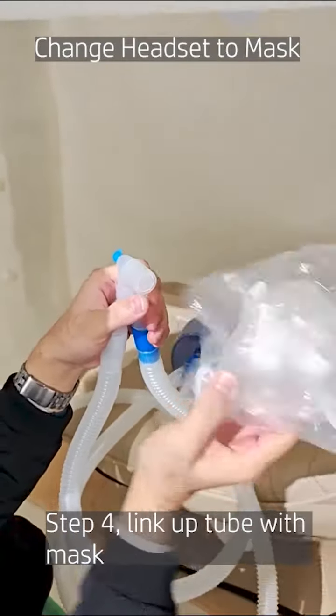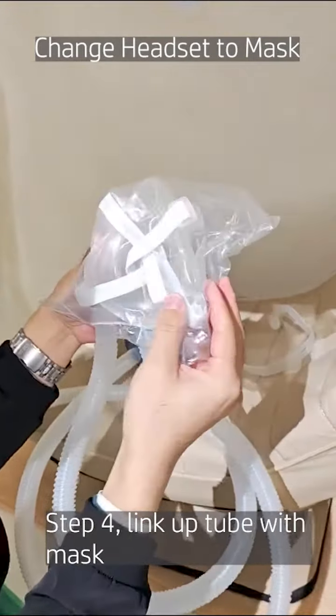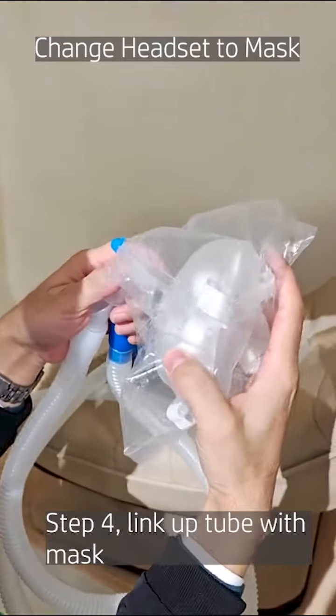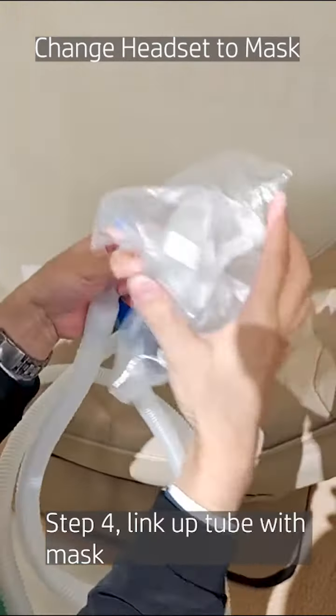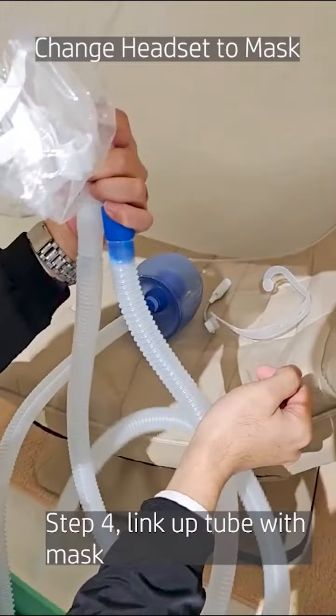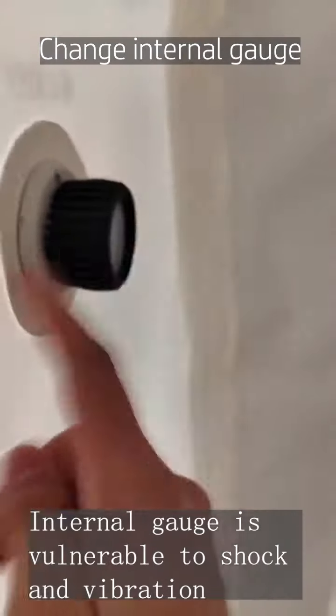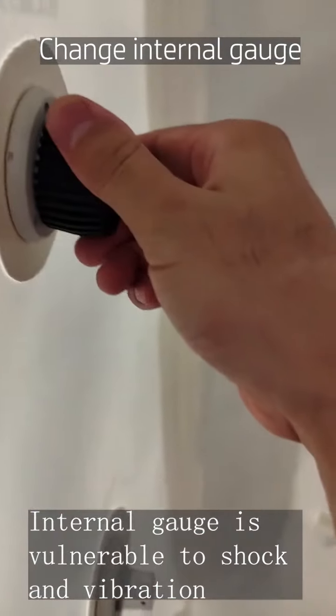Step 4. Link up tube with mask. This is a spare gauge. Internal gauge is vulnerable to shock and vibration. In case of malfunction, we need to replace it.